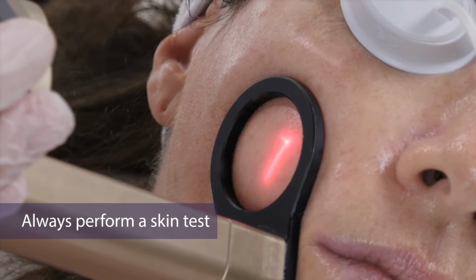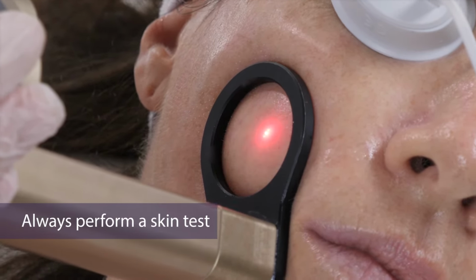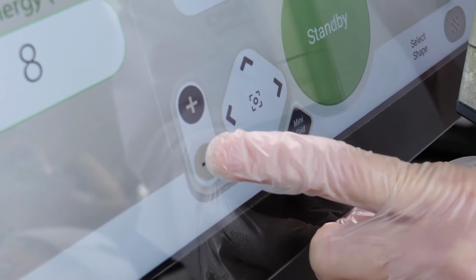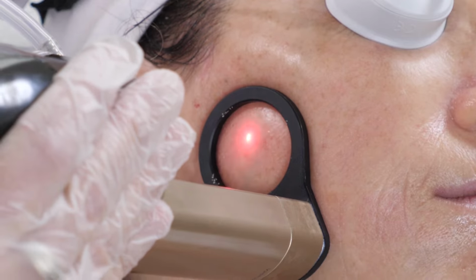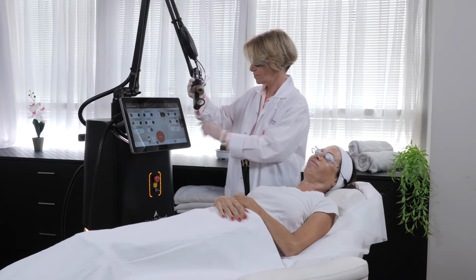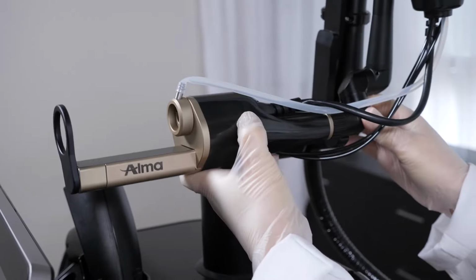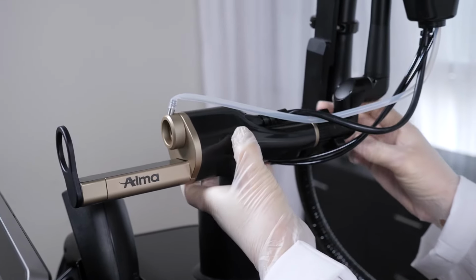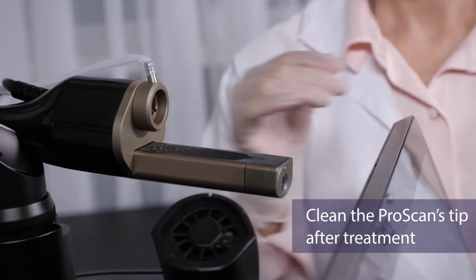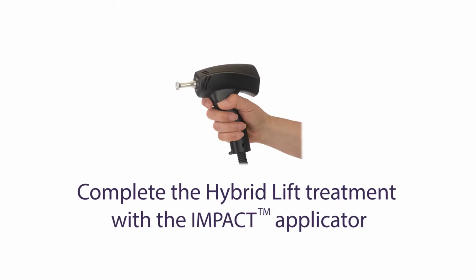Always perform a skin test. Change the size of the scanning area as needed. Upon completion, switch back to Standby mode by pressing the Ready button. Detach the cooling tip by turning it 45 degrees clockwise and clean the applicator according to the operating manual's cleaning instructions. Complete the hybrid lift treatment with the impact applicator.